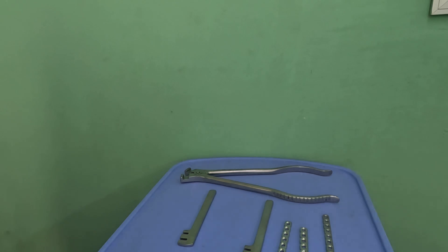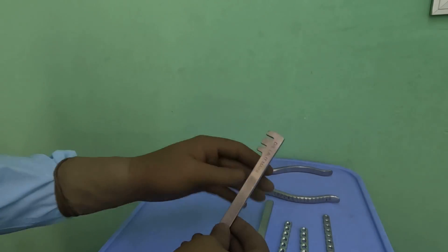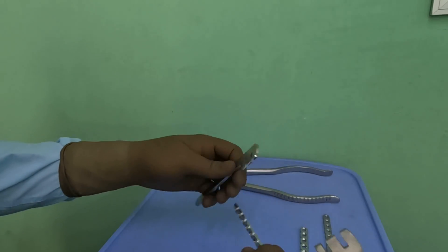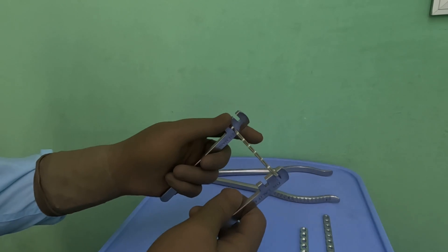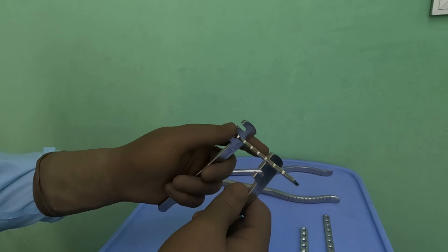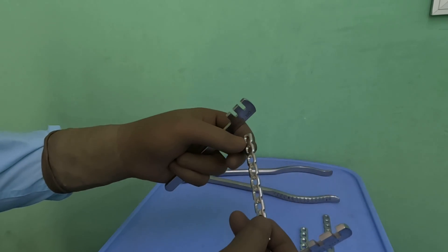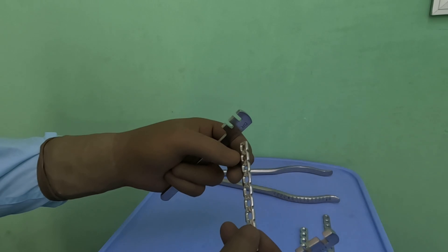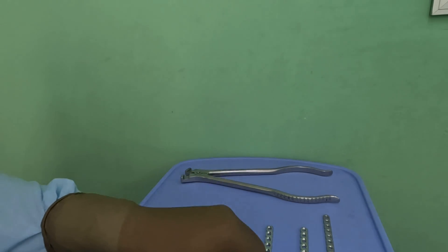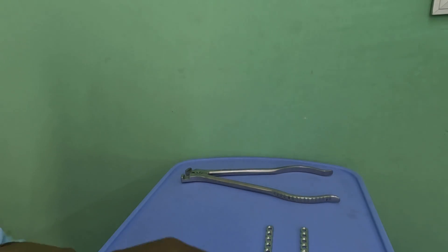I will keep it simple and show you how they are bent. These are the L benders — they are used to bend the plate by holding it in between the teeth. You hold them here and apply stress to bend at whatever place you want. These cuts facilitate bending away from the screw holes, though they are not perfectly accurate and can still bend through them.